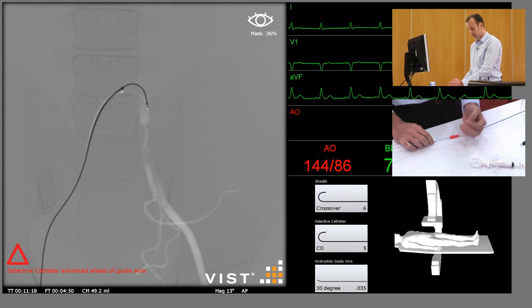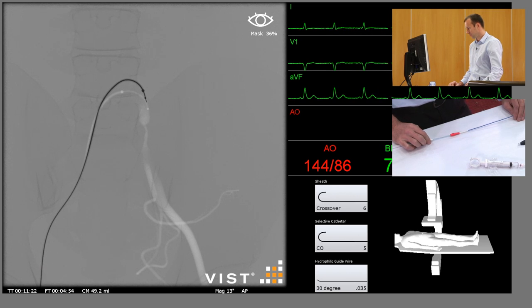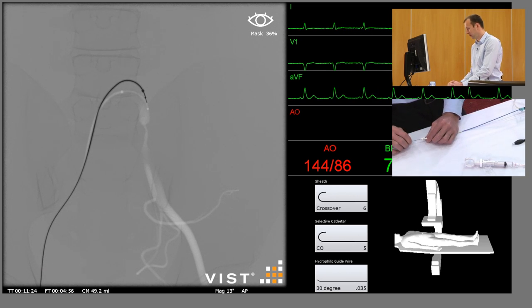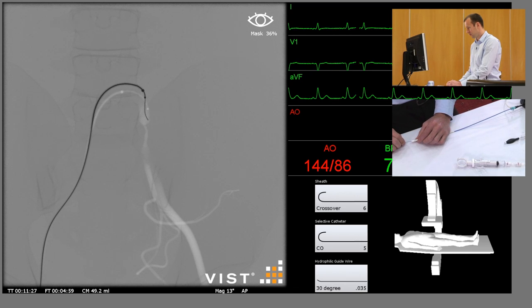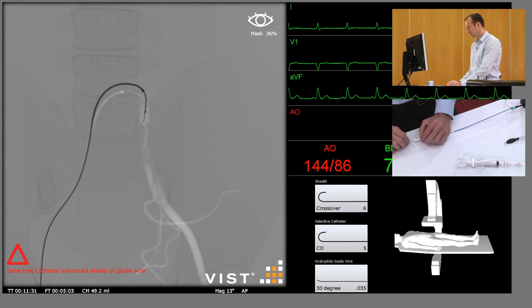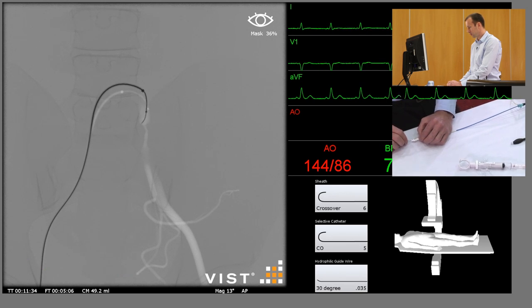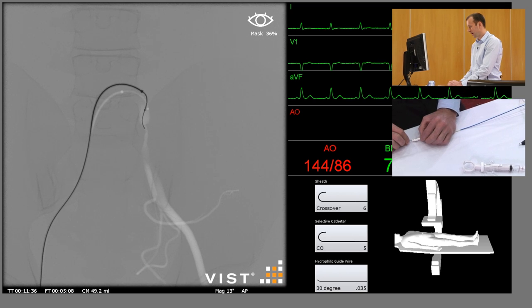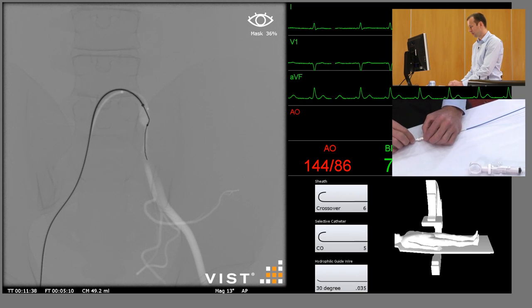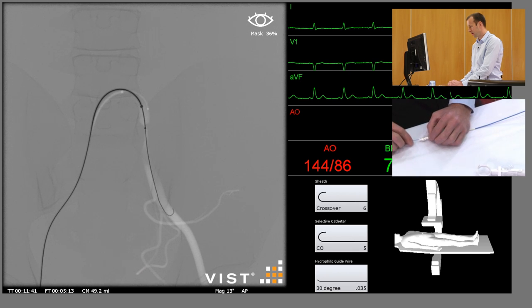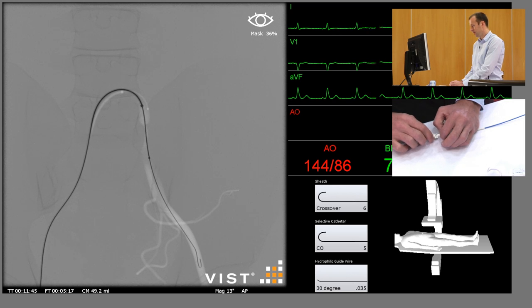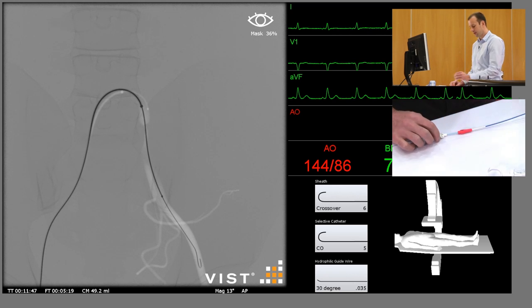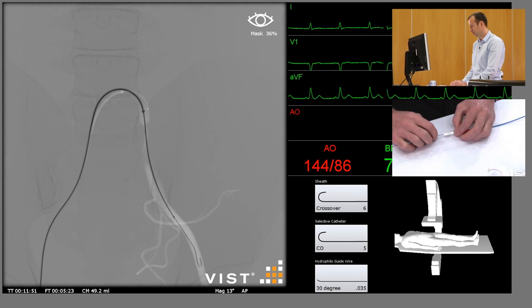Again I think we need a little bit more support from the crossover sheath, so advance that no further than the tip of the catheter. Advance the catheter a little bit further and angle the guide wire to cross the lesion. We'd like the guide wire to go down the external iliac artery. Follow that with the catheter, and I'll advance the sheath just a fraction more to give us maximum support.